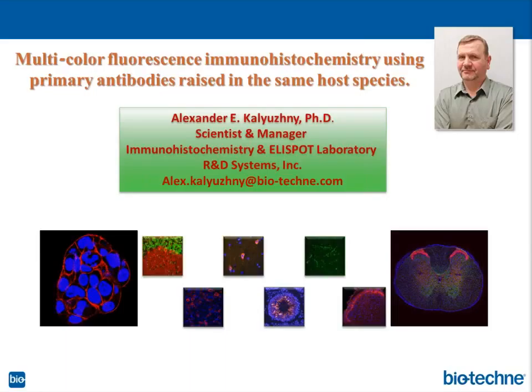So they're more sensitive, but if you do incubation when there's no treatment required, like the tissue sections of the rat brain I have shown you, they're all frozen tissue sections, and they can be used nicely with this protocol. We have a sequence of conventional staining with the DIG and biotin labeled primary antibodies. Okay, I hope I answered the question.